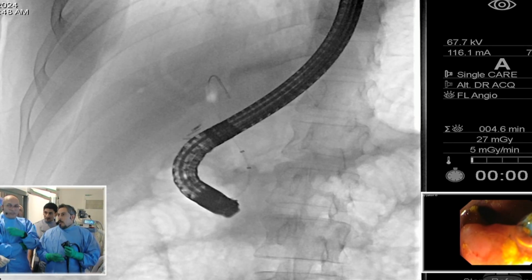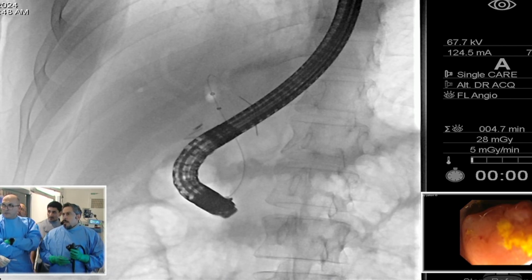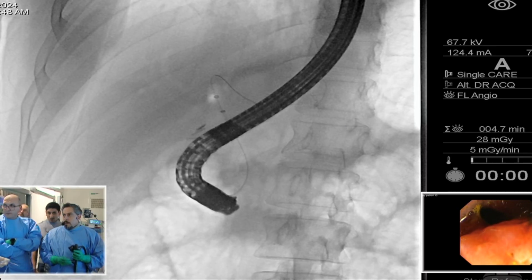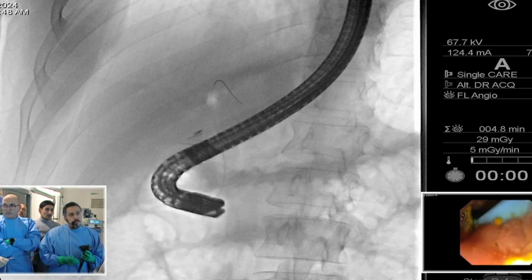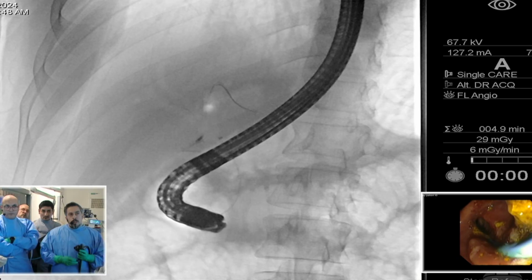I agree, actually. It's very interesting you mentioned that. There was a study, I think 2 or 3 years ago, in the AGA Red Journal that exactly described that. And it showed that the risk of cholangitis went down with this approach, when you actually try to clean the tiny fragments with sterile water.